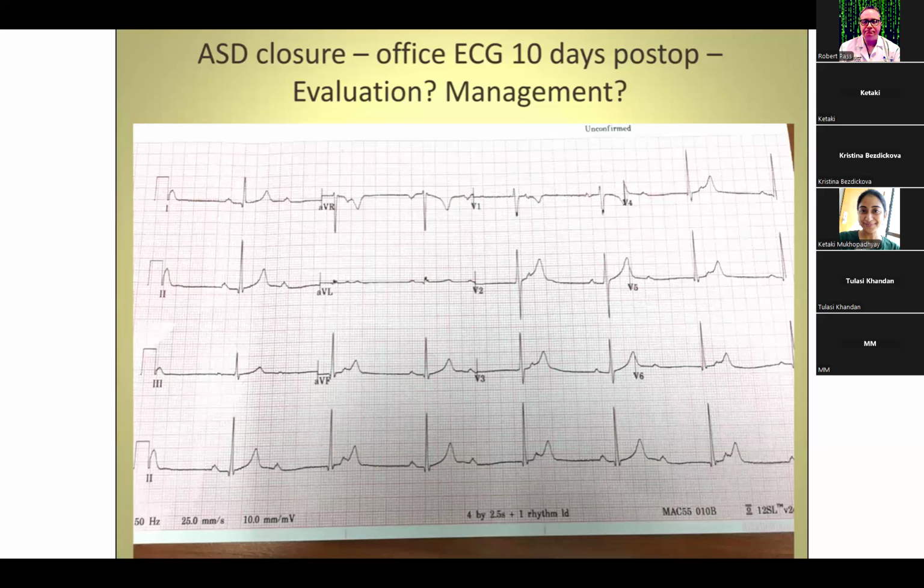So is there a consistent relationship of the P waves to the QRSs here? No. Not really. Right? So I think this is probably a complete heart block. I think you're right. The only mild caveat is that this PR interval and these three seem to have a similar PR, so it makes me wonder if perhaps there's conduction.